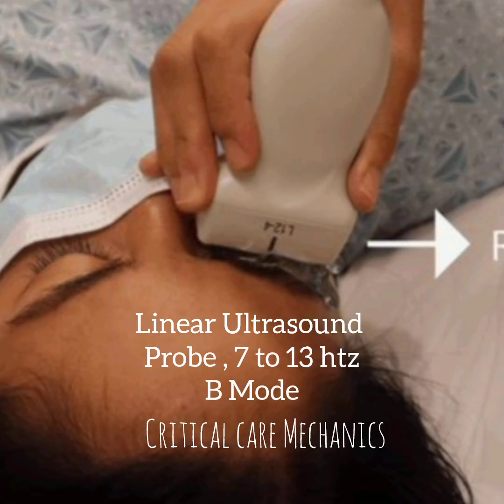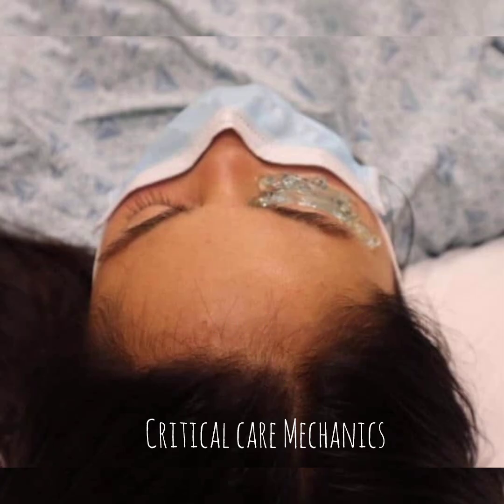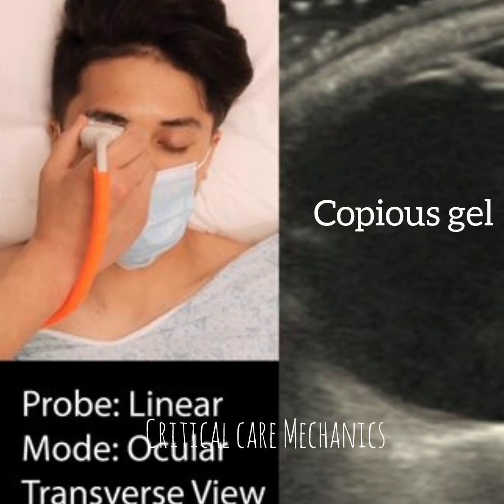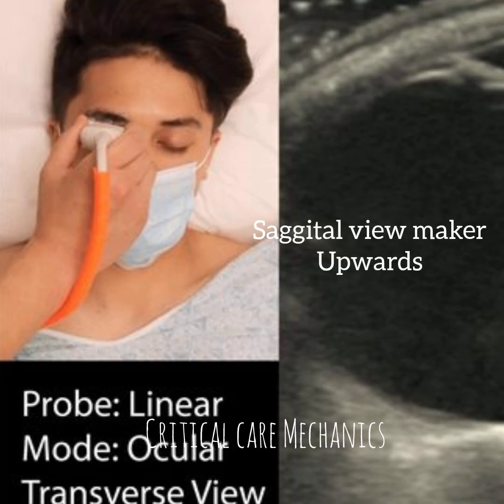Equipment is a high-frequency linear probe, 7.5 MHz, of an ultrasound machine in B mode. The patient is placed in supine position with eyes closed. Apply copious gel over the closed eyelid but avoid excessive probe pressure, which can falsely reduce ONSD. Probe placement: place the probe gently over the closed upper eyelid. Orientation: transverse view, marker toward the temporal side; sagittal view, marker toward the head.